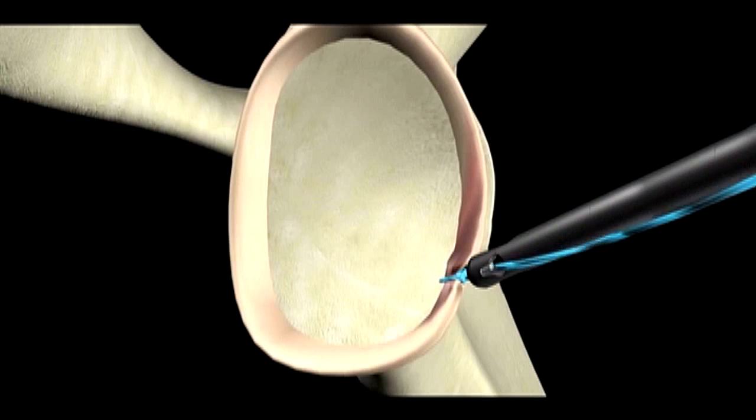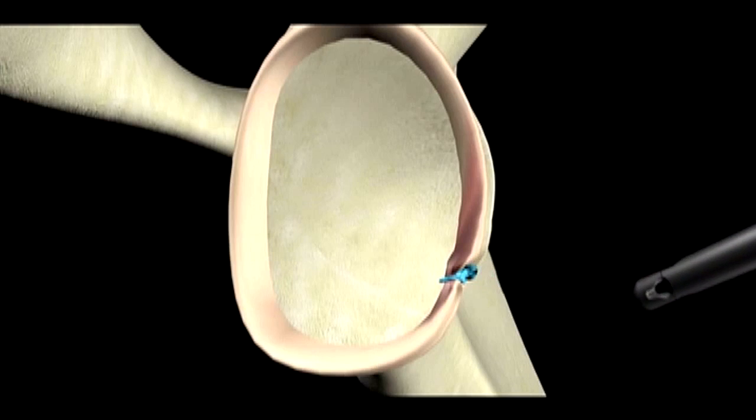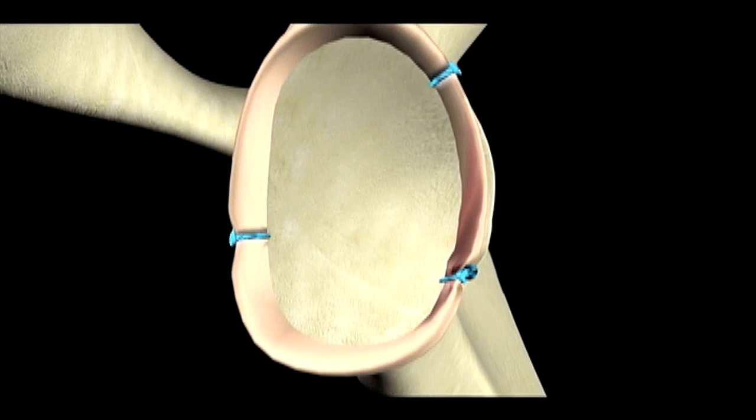The slotted max cutter suture cutter can be used to cut the max braid suture. Additional anchors may be placed as needed.